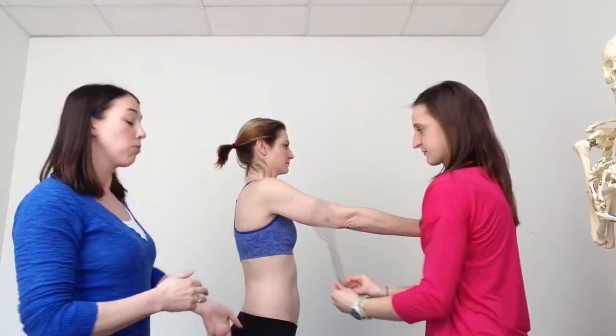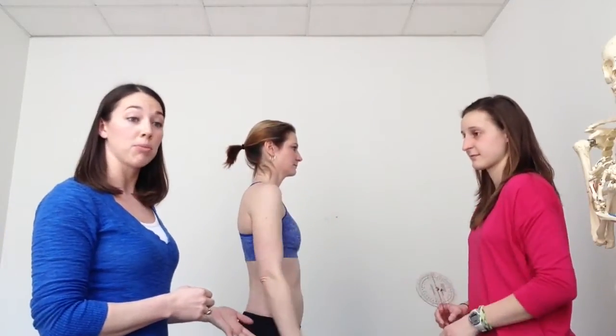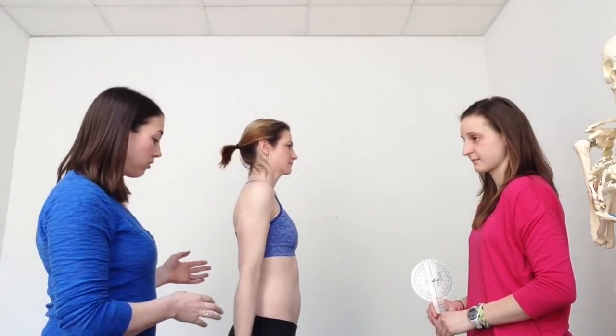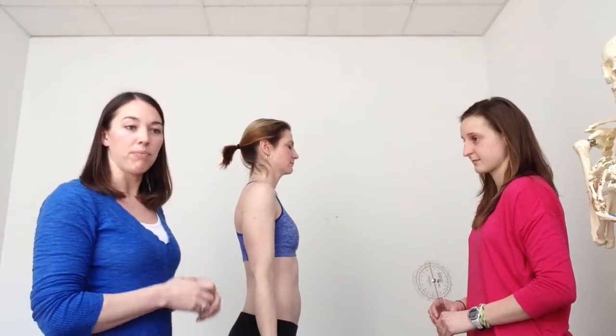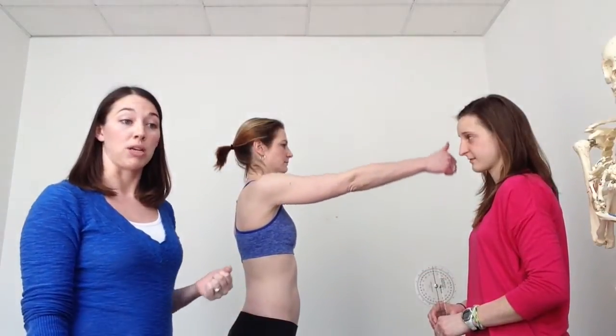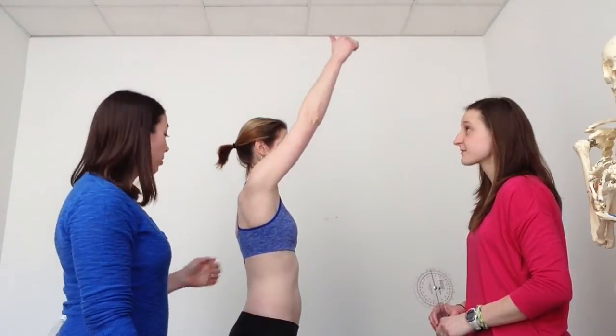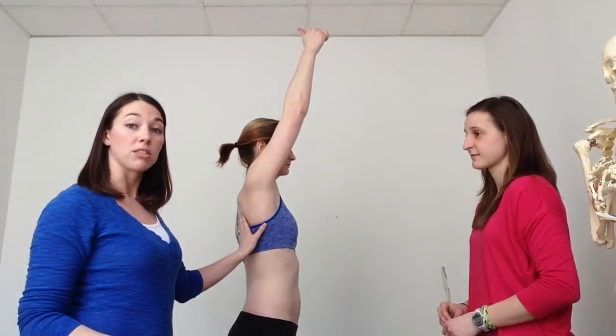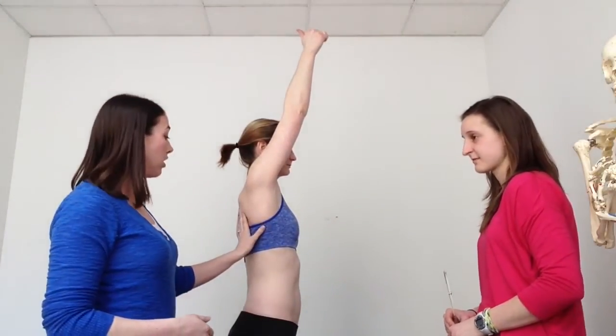So you will start with your patient's arm in a dependent position, visually confirm that they can zero. Great. Ask the patient to flex their shoulder with their thumb leading. That way you minimize the risk of impingement. Place your hand on the patient's thorax so that you can monitor for any compensations and feel for end feel.